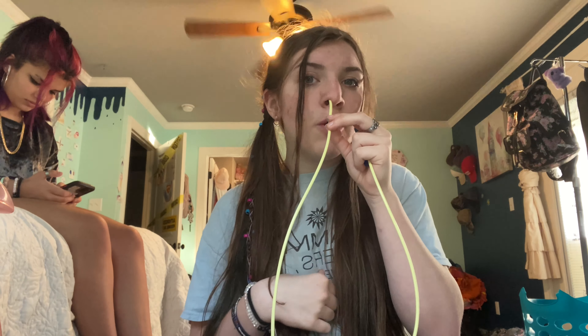Most people, if you have this kind of tube, yours is probably going to be pink if it's an NG. For some reason, my people send me NJs, so mine are just really long. You're going to want to keep watching out for your number, because you can see them come up. You just put your number right there at your nose — and mine is there.